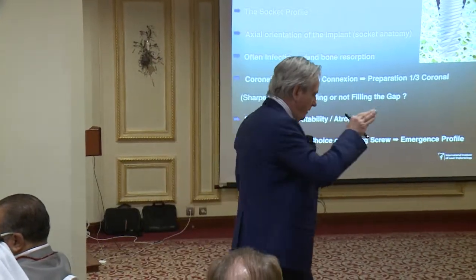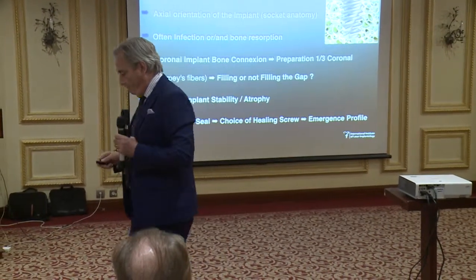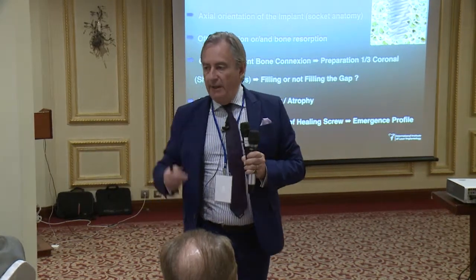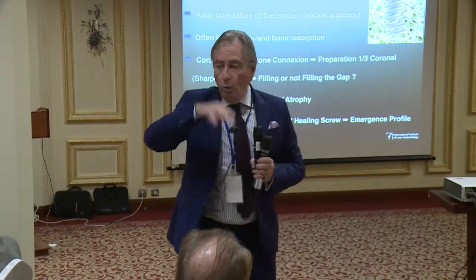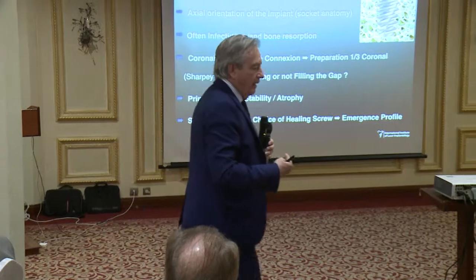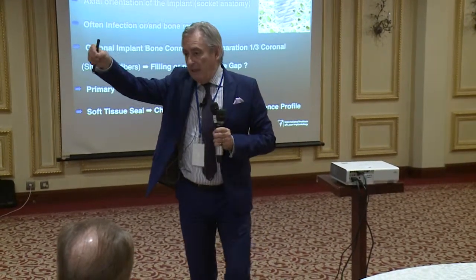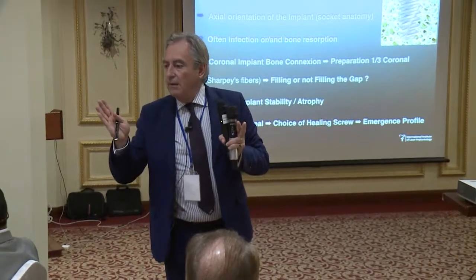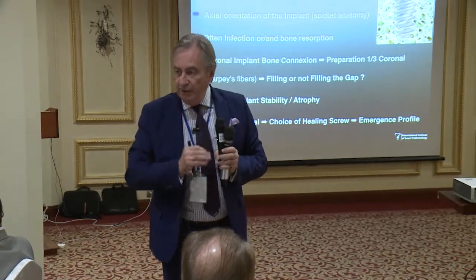If you are working in two-stage in one, that means you place your implant immediate post-extractive, and either you place your healing cap at the same time, or now, which happens to me very often, going to immediate loading at the same time, using either a permanent abutment or a provisional abutment.